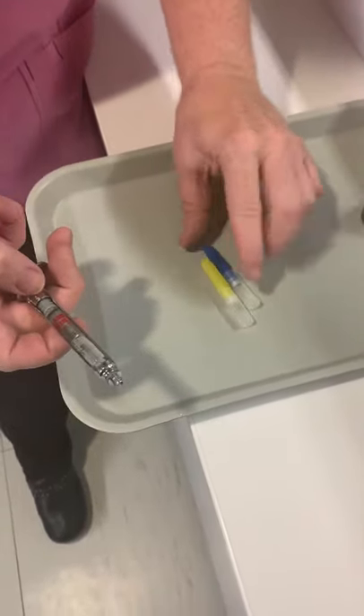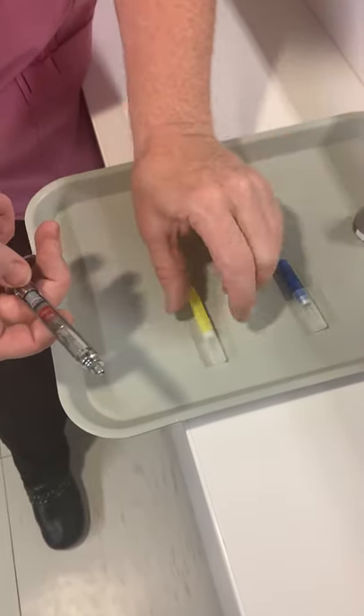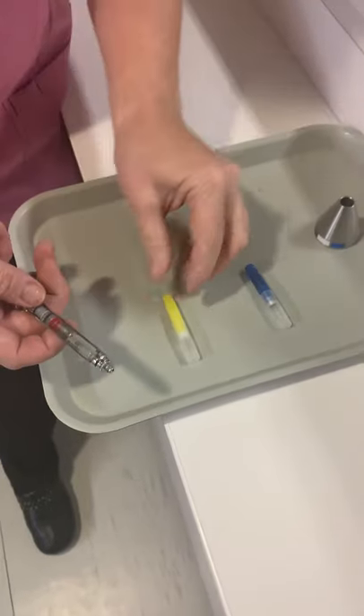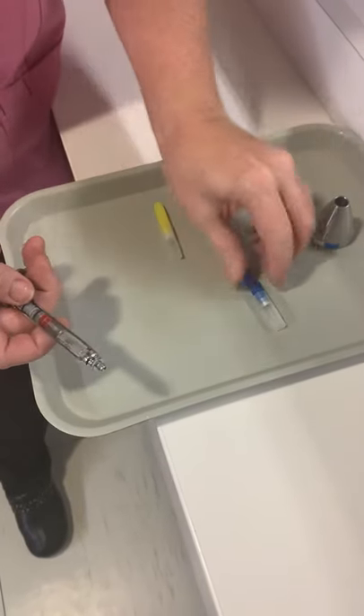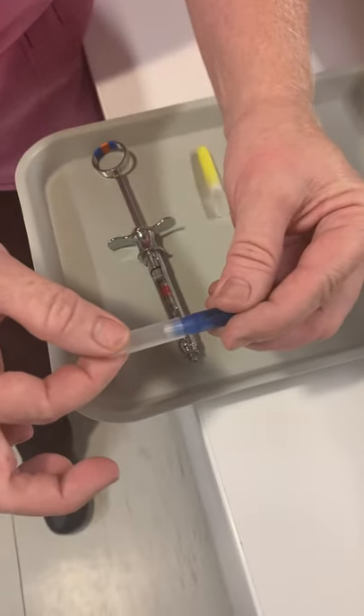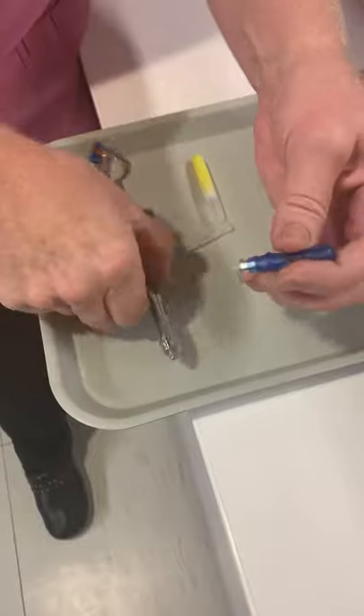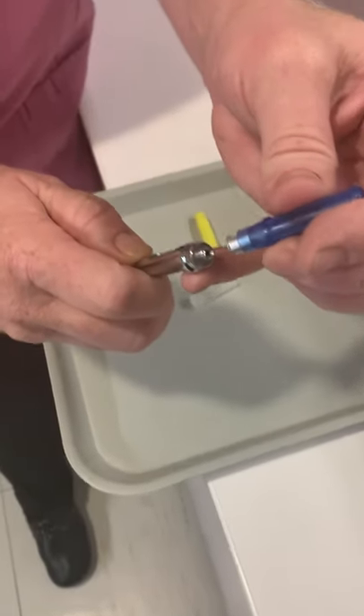For needles, we have a blue needle which is a short needle for infiltration, and a yellow needle which is a long needle for a block. We're going to load the short — actually, let's do the yellow. Take off the white cap to expose the needle and make sure you have a fulcrum.